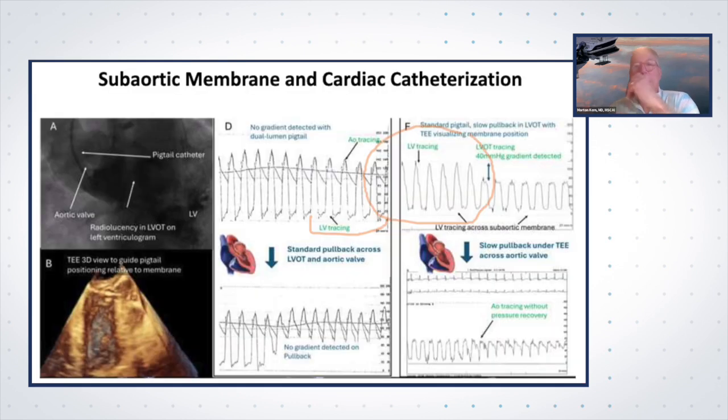And then I did want to ask you some detail about this graphic because it's fascinating that on the left, this is a typical normal aortic LV pressure relationship. On the right, you have your gradient identified with your pigtail between the two. And I presume if you would have had an aortic pressure, it would be down here in the lower, at the gradient level.